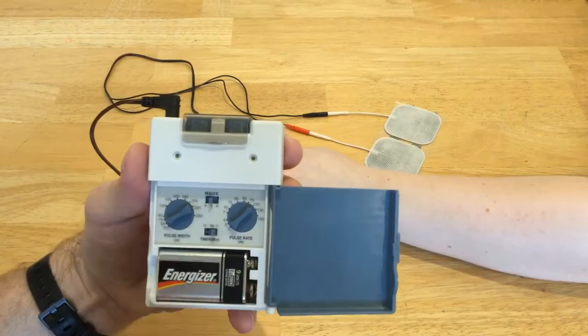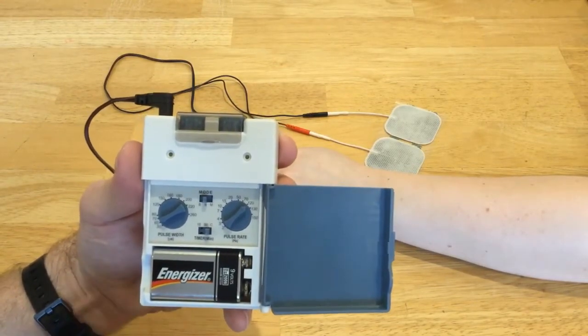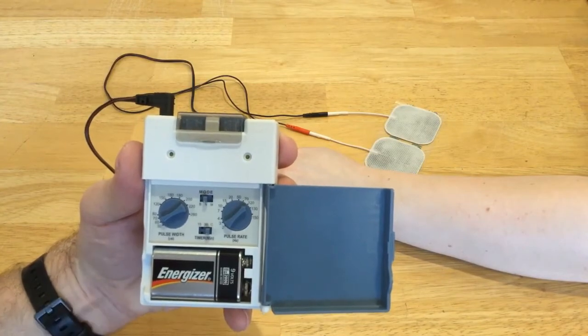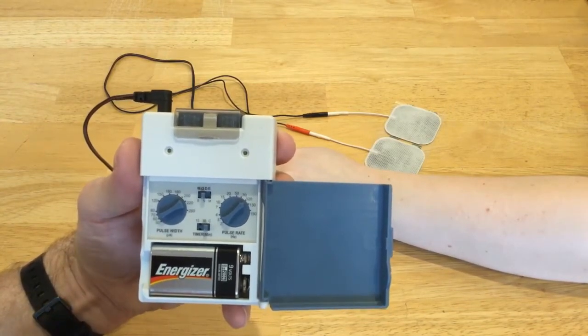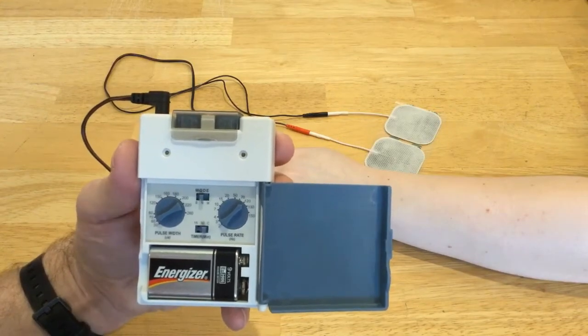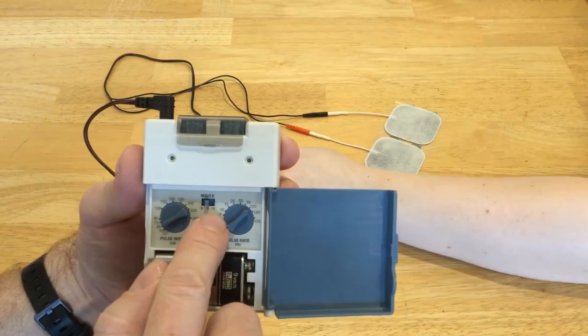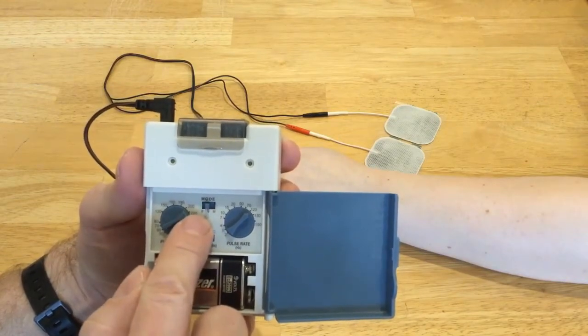For mode, I just have it set on N, which means not modulated. That's the most straightforward waveform and the easiest one for clients to get used to and be able to report what they're feeling. You can also put it on M for modulated or B for burst.